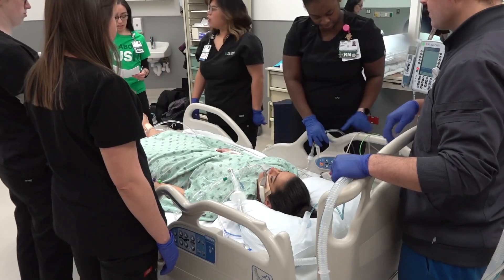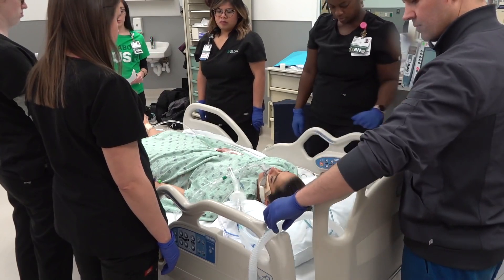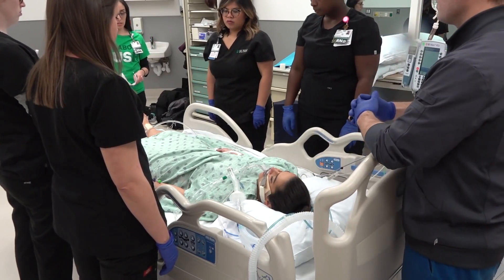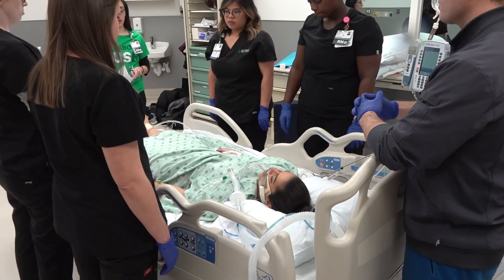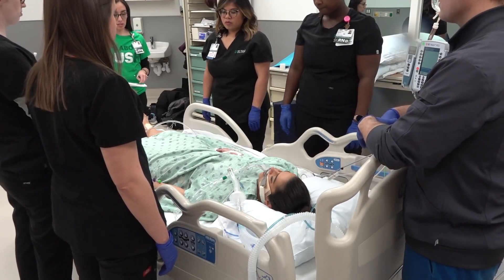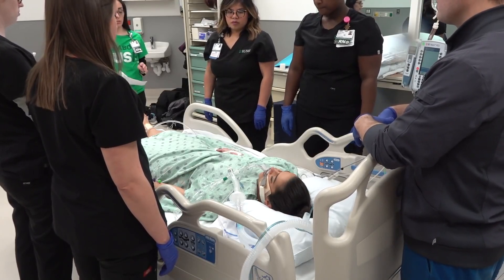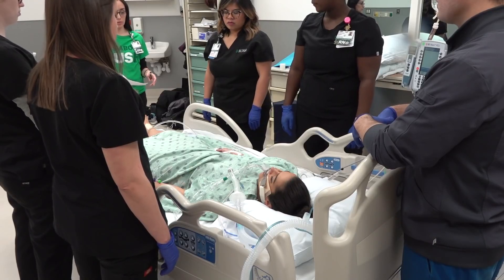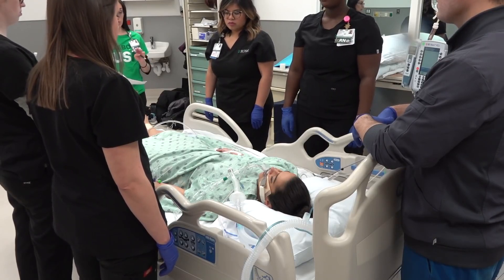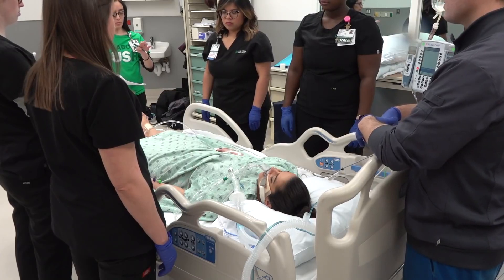Phase two checklist. The turning crew will be gathered, which consists of five to six members. Ideally, the sixth person is hands-off, reading the checklist steps out loud, and monitoring vital signs. The fifth person is the respiratory therapist, located at the head of the bed, and two staff members will be present on each side of the patient.